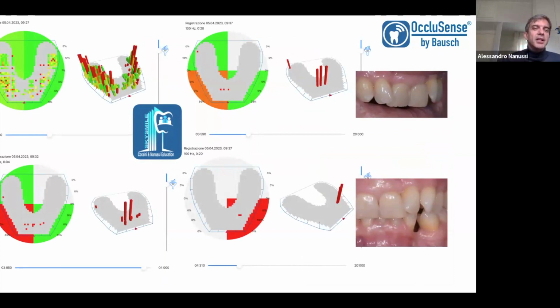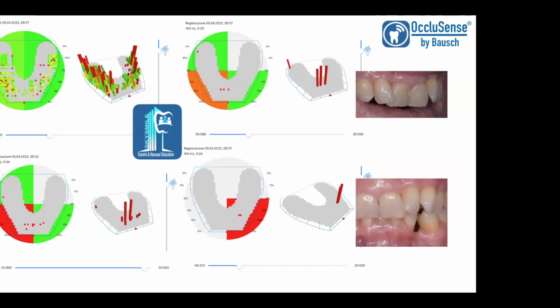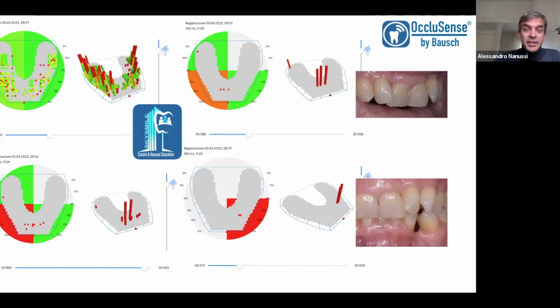Well, in usual intercuspation, there is a surprise because you can see in the upper part of the screen on your left, we don't have overload on anterior teeth. This is interesting because it is not what I expected. When there is a load, as usual in protrusion, or also in the right lateral movement, she doesn't move her jaw only in a left or right direction. When she moves the jaw in her right direction, she also has an anterior precocity of contact.